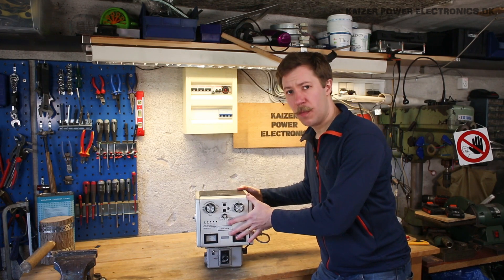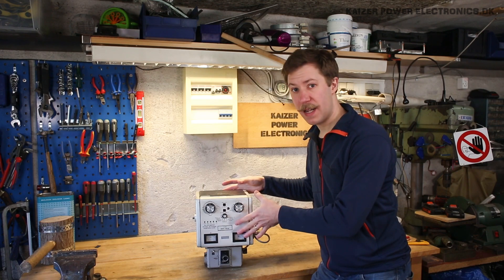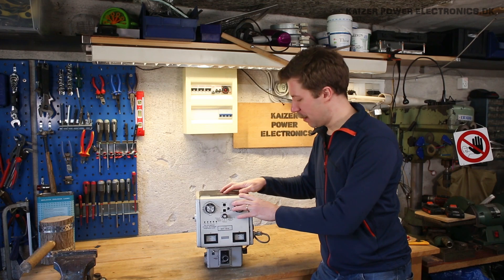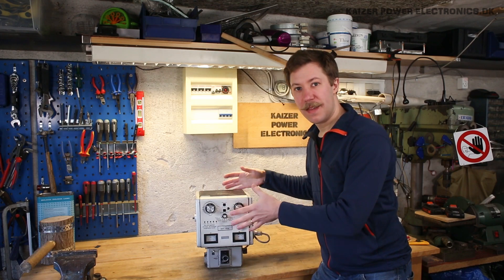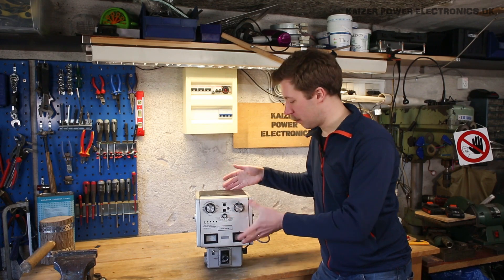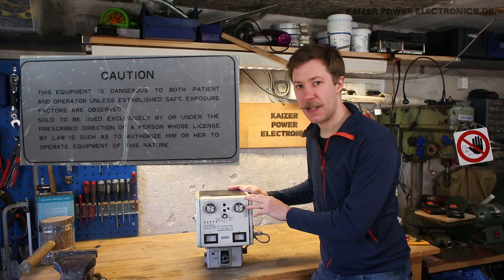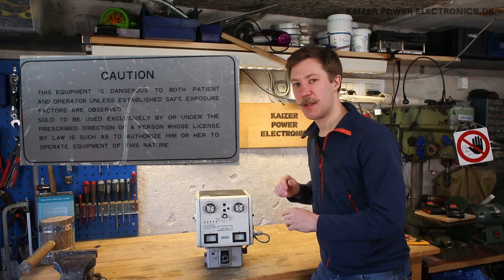It's the size of what you normally see in a head at the same ratings. So it would be rather interesting to see how compact this is. Or if it's really just not that well made, well shielded. It has this fine little shield up here saying it's both dangerous to patient and operator. So let's take a closer look at that.